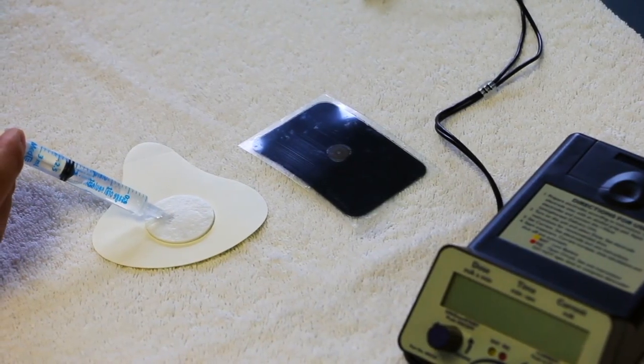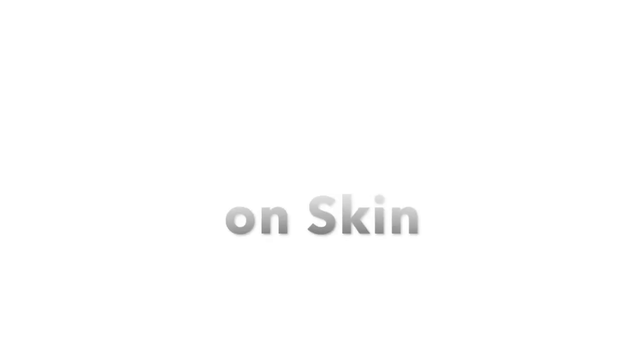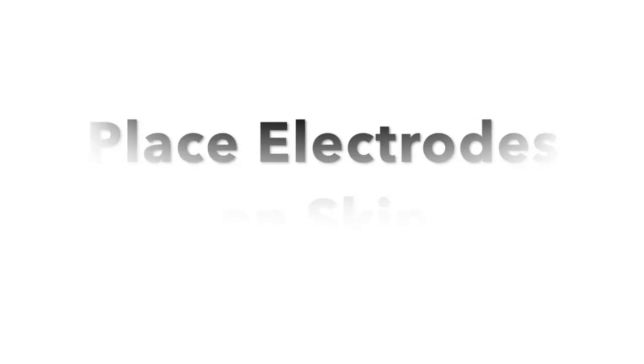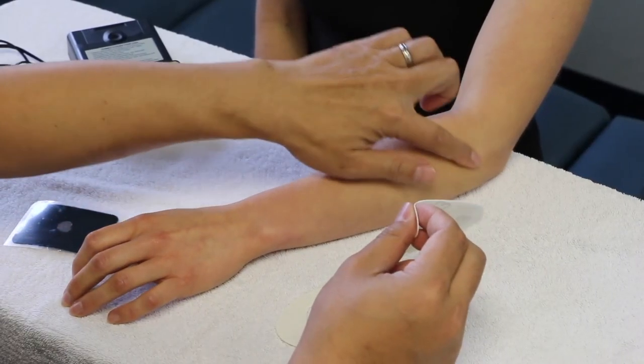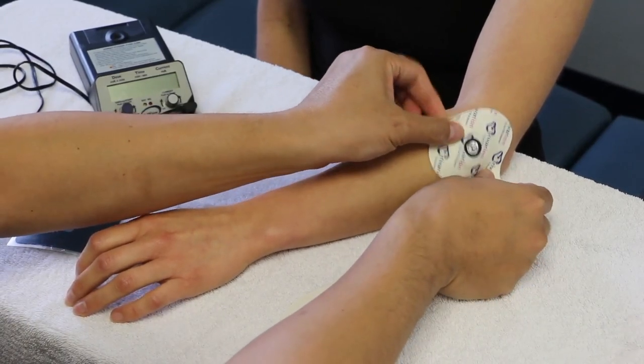Using a syringe, inject the appropriate amount of medication into the pad. Place the electrode with the medication over the target tissue and make sure the electrode is in full contact with the skin.